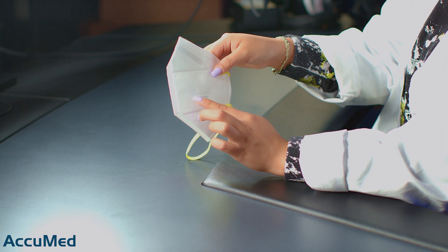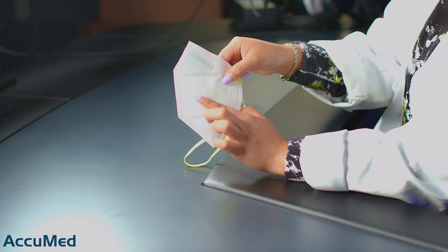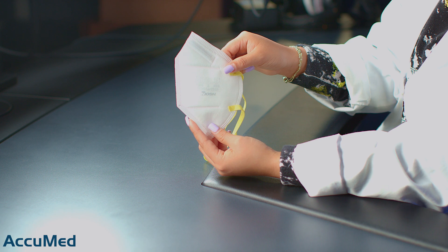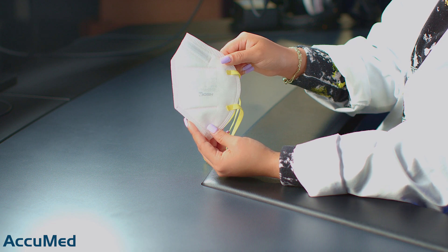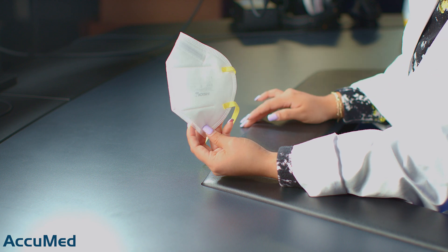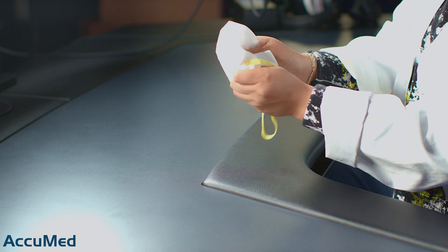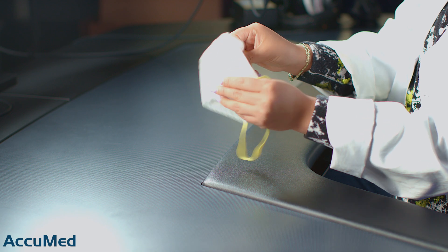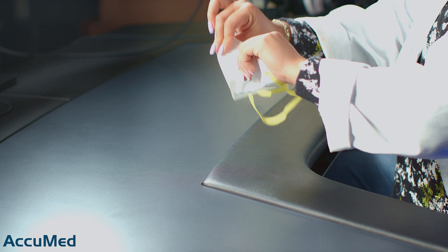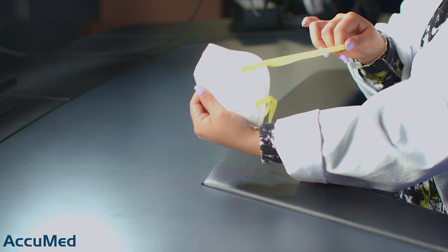Now let's take a look at these respirators. Because of the color and the print, you really aren't able to see what it says, but it does have all the N95 requirements: the manufacturer, the model, the TC approved number along with the lot number, and the NIOSH N95 stamp. These are very thin and not the softest material. It's a pretty standard nose wire, but it's a bit on the weaker side. These have a 5-rib headband, which tends to be a bit on the tighter side and not the most comfortable.